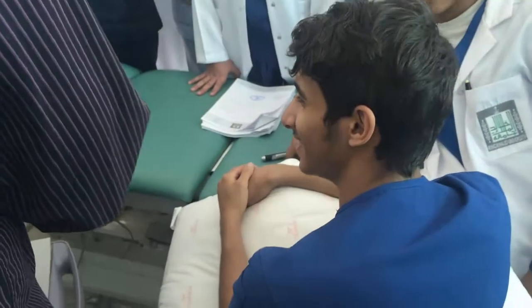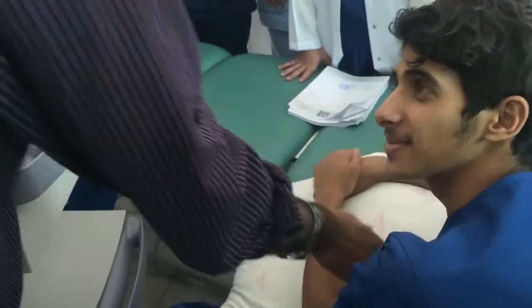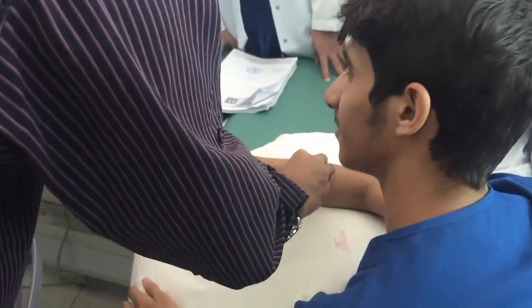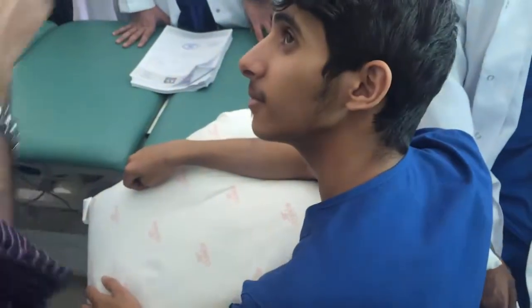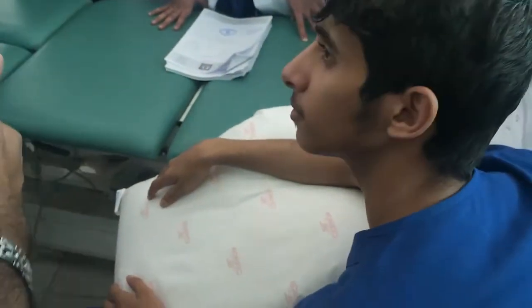Once we finish the treatment, we have to switch off everything, remove everything, put it to this side, and remove the pillows, and we have to check the area and note down what treatment we have given, and we should tell the patient to come tomorrow or the day after tomorrow for further treatment. All those things, understood? We have to terminate, we have to wind up.